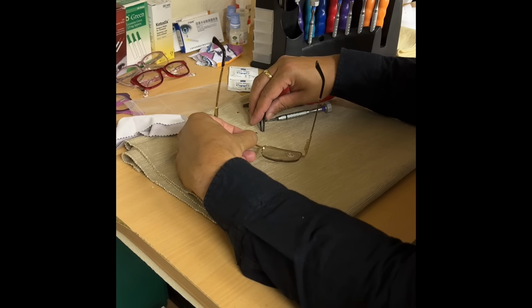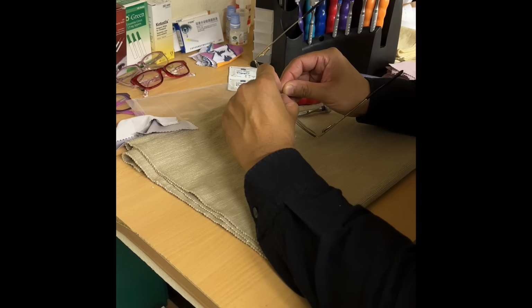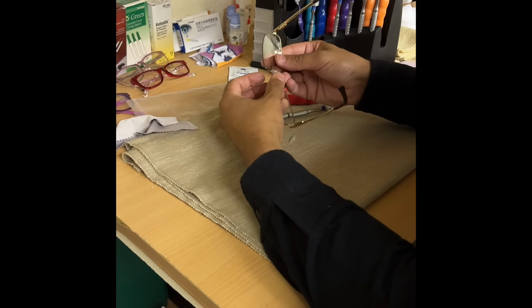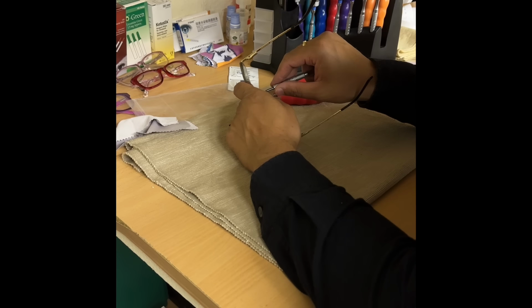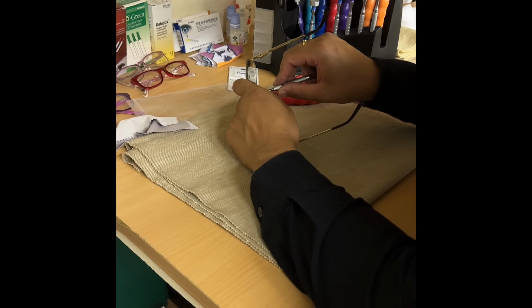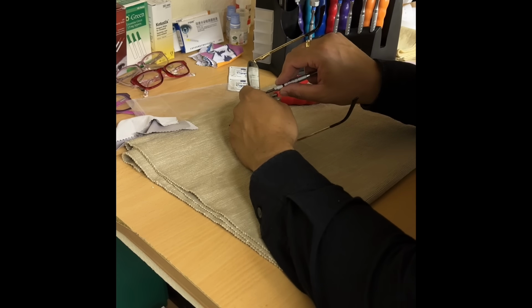So let's see if this screw is going to cooperate. Usually they don't. Usually you just have to switch to a manual, rather than using your fancy equipment. Again, delicate job. Nicely, considering it's the same screw. Into the groove.